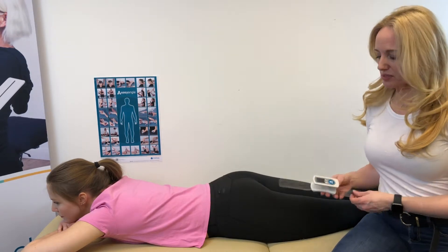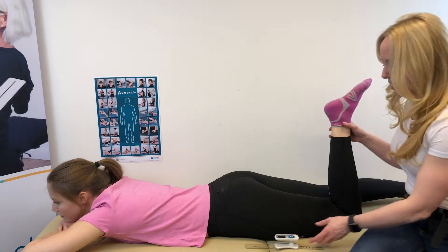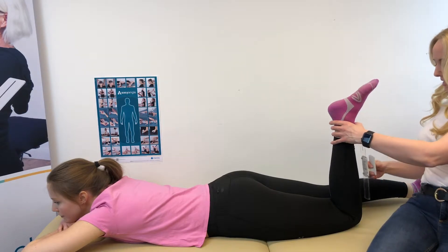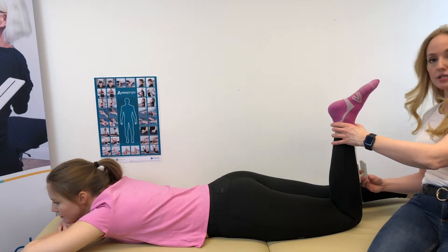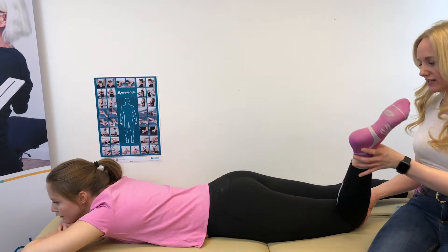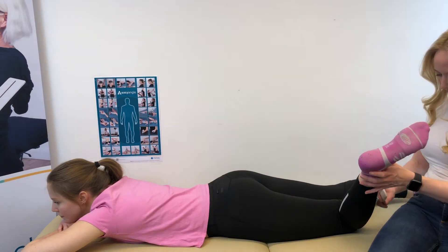To set the plane in which we want to measure, we will take the patient's leg — the lower leg — and place the easy angle against the tibia, then press the button to start the measurement. We can then help the patient find their maximum internal rotation and again align the device with the tibia.